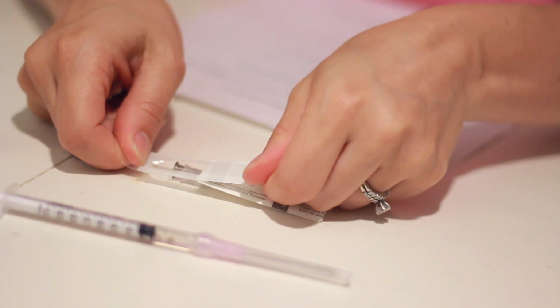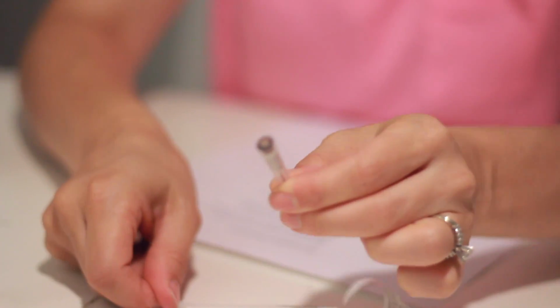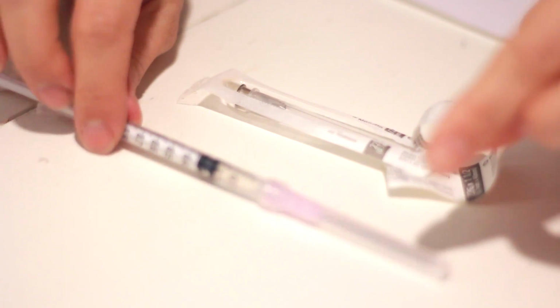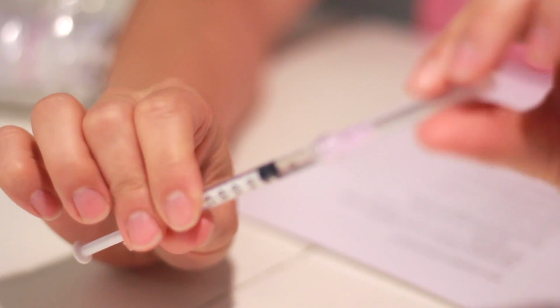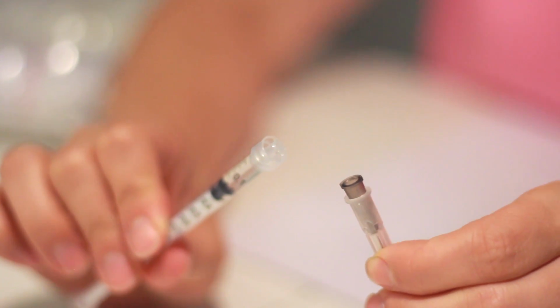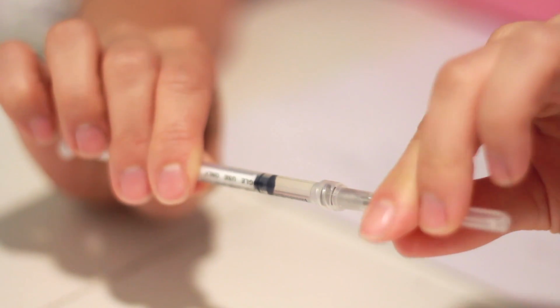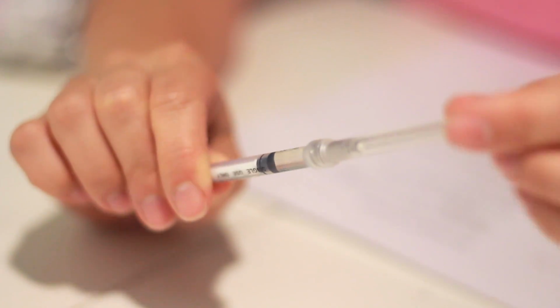So now I have my 22 gauge, which is a lot friendlier, nicer needle in my opinion. And I'm just gonna open that one up. Again, try to keep it clean, not touch it. And I'm gonna grab the plastic. If you're comfortable, you can pick this one up and switch it. If you're not comfortable, you can pick up your syringe, unscrew the needle that you don't need to use and set that one down, and then just pick up your other needle, and both places are still clean. Both of these tips are still clean. And then I'm gonna be able to screw it on directly. It hasn't touched anything. And you're pretty much ready to go.